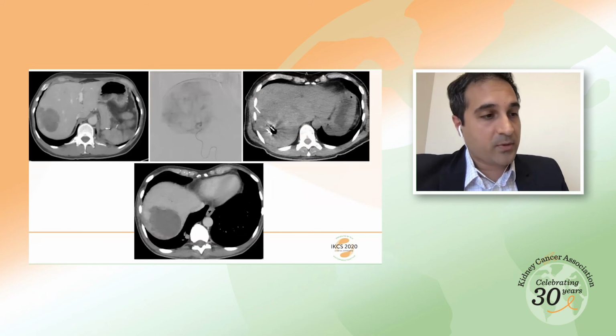So as an example, this is a patient with a large, approximately 7-centimeter metastasis involving the right hepatic lobe. We treated it first with transarterial embolization. As you can see here on this angiogram, the tumor can be very specifically treated given the arterial perfusion of the tumor relative to the background liver parenchyma. In this case, because the patient's tumor was sensitive to doxorubicin, we performed chemoembolization by delivering microspheres that elute doxorubicin.